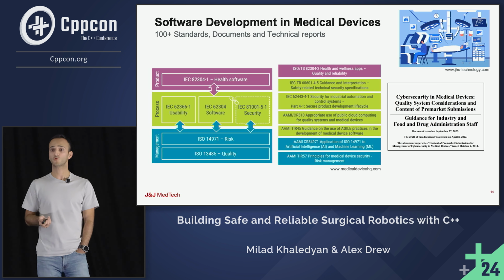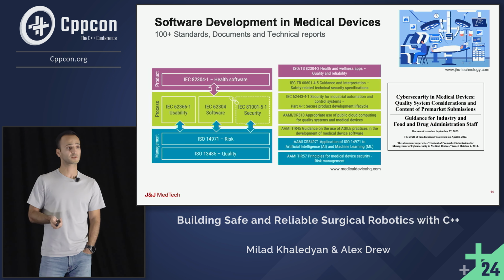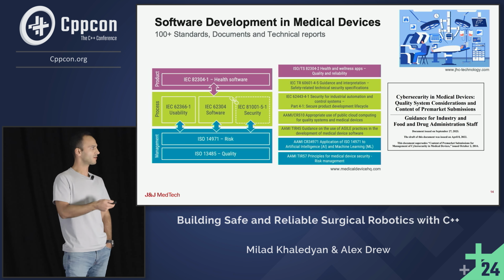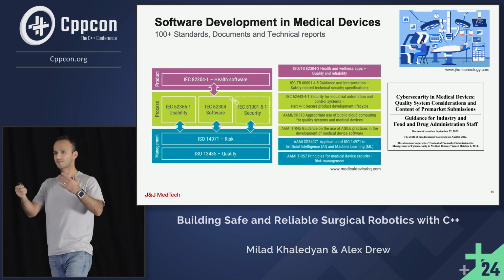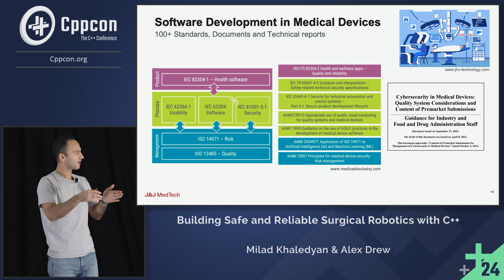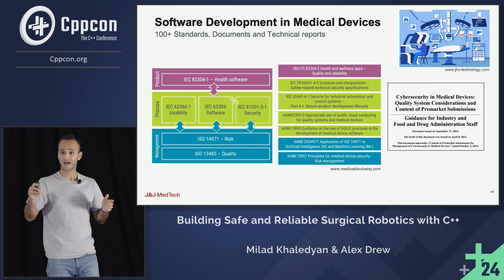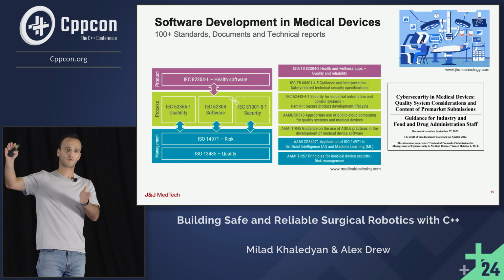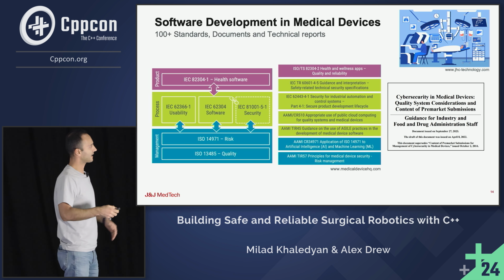They put out a pretty comprehensive report in 2023 on cybersecurity for medical devices, and in 2024 they actually had a revision. I didn't bring it here, but it's still a draft. But given the increasing complexity of cybersecurity and all the attacks, they keep updating these standards because they have to keep up with the increase in attacks.